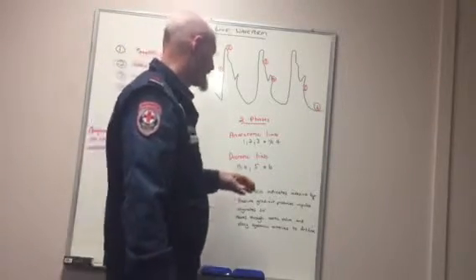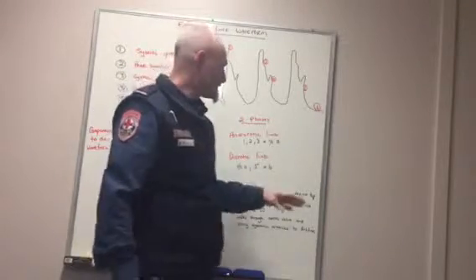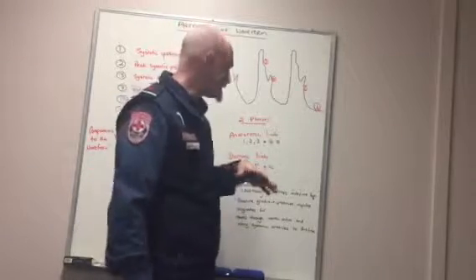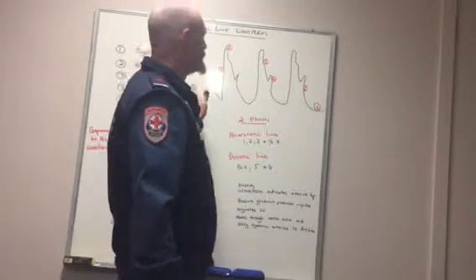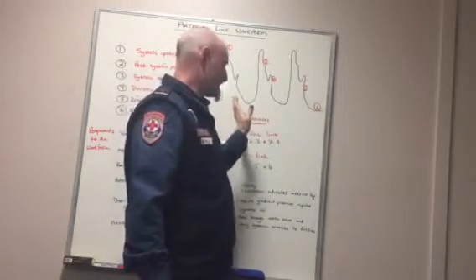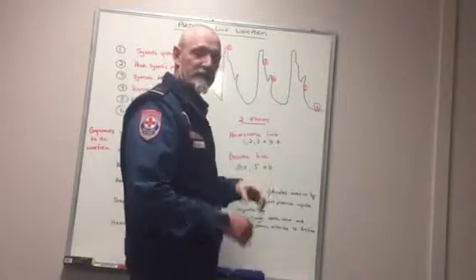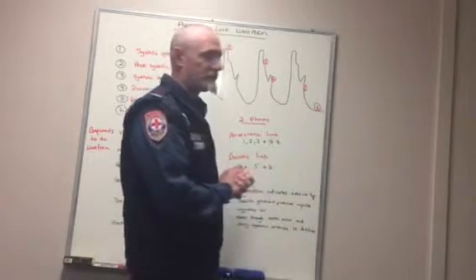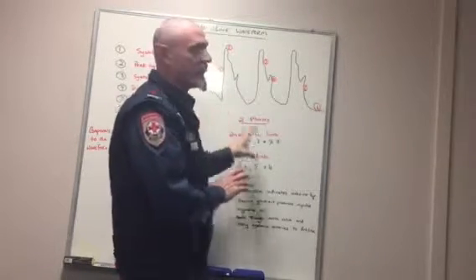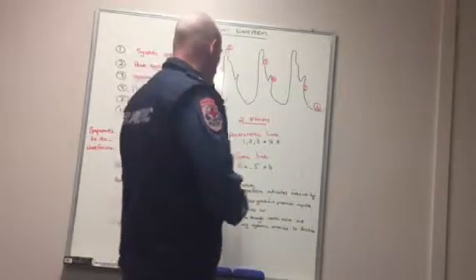This pressure in the waveform is a gradient which produces an impulse originating from the left ventricle, and it moves through the aortic valve and along the systemic arteries, and then comes to the art line itself. The art line then goes back into the monitor, through the components of the art line, and that's how we get our readings.